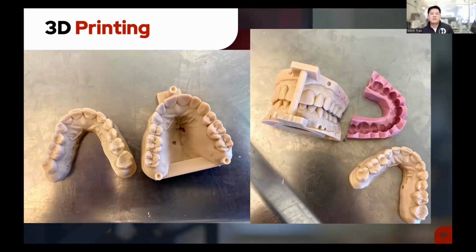If you're using more of a dual cure material, then of course silicone matrix, I find it reproduces surface detail a little bit more. And especially now with my diagnostics, you get a lot of surface texture, a lot of incisal details that you really want to replicate and show the patient.